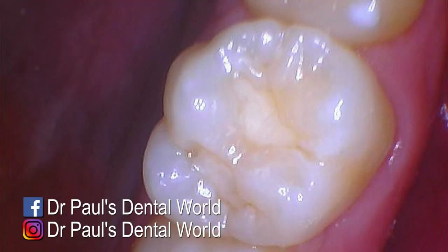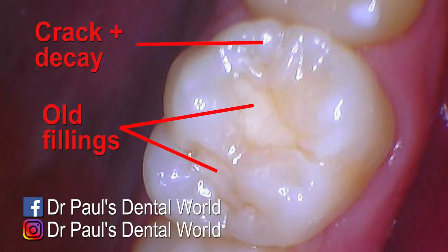So this is the tooth we're working on today. As you can see it's got some old fillings that have decay underneath them, and the front part of the tooth also has a crack which also has decay.